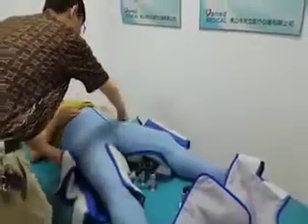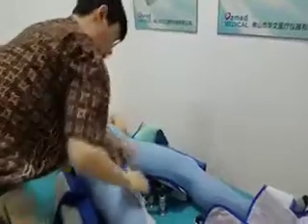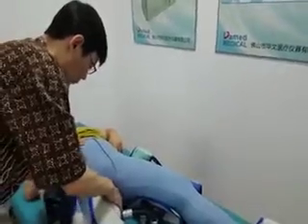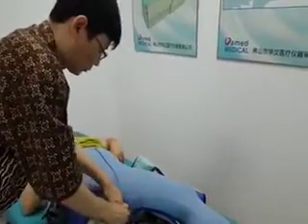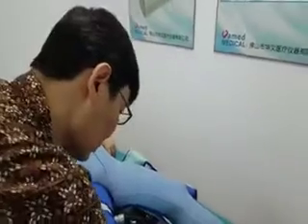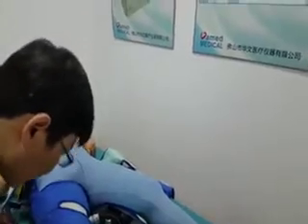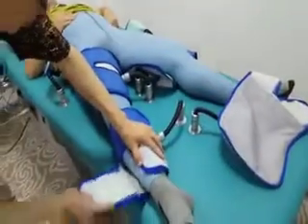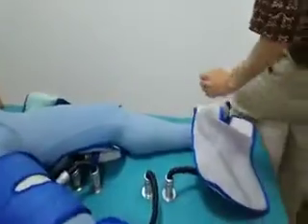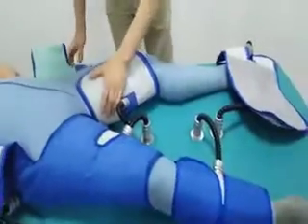Please ask the patient to lie down on the treatment table, and remind the patient to go to the toilet before wrapping the cuffs. Wrap the cuffs on the patient in the order of lower side, calf, and upper side, then connect the hose last. Our engineer is wrapping the upper, lower side, and calf, one side at a time.